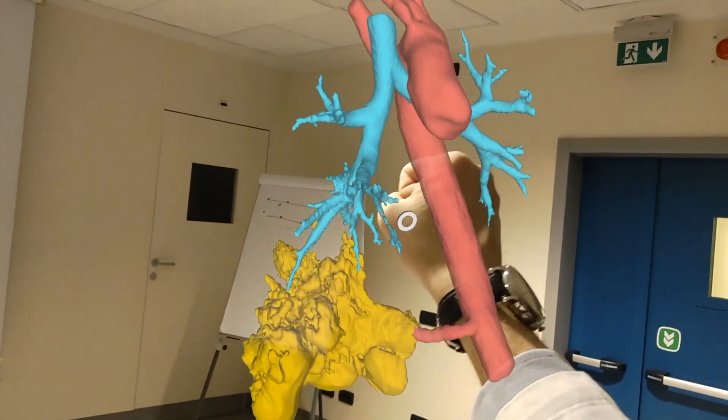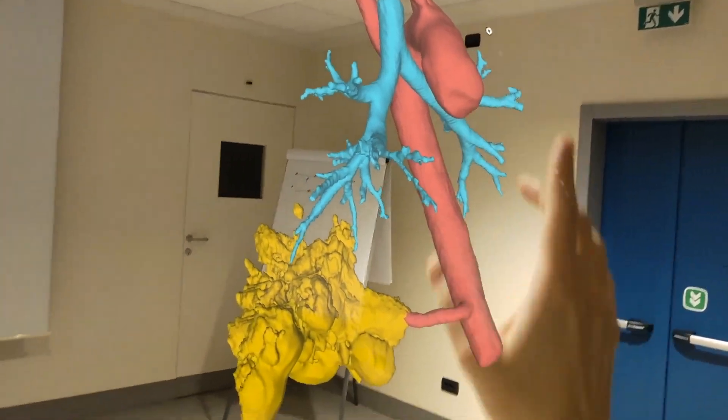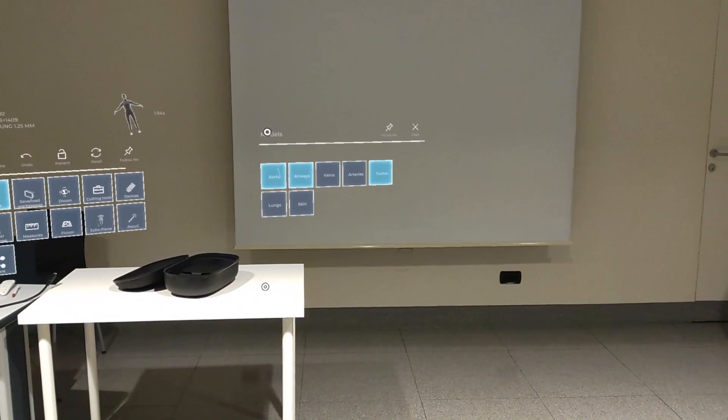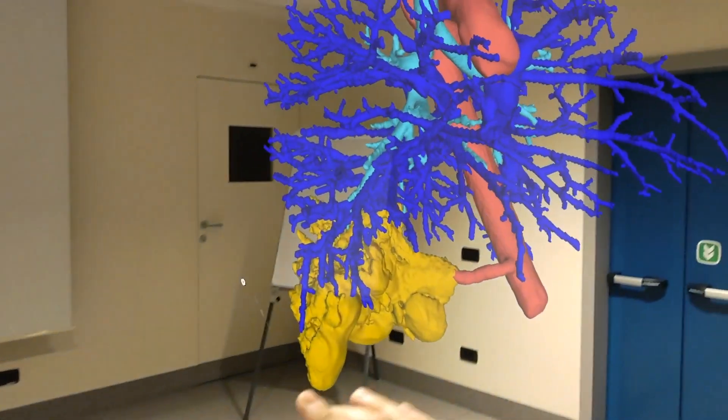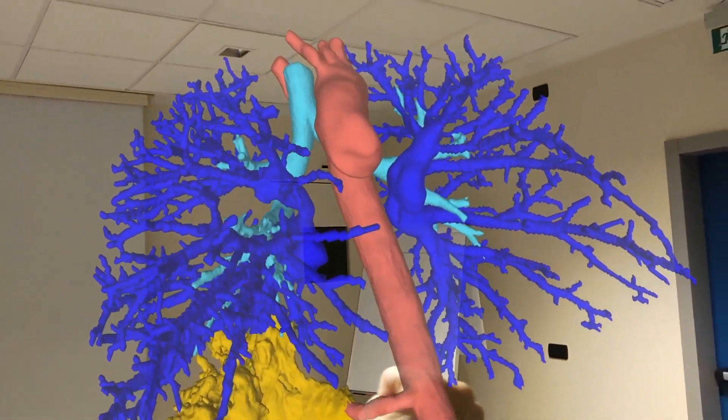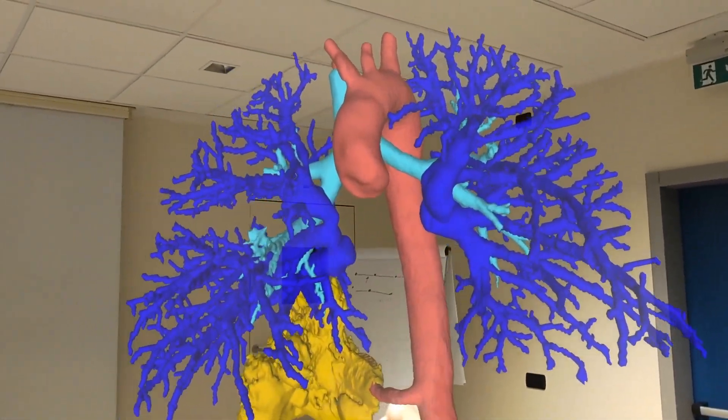After visualizing the pulmonary artery together with the bronchial tree to better localize the artery branches, we can remove the bronchial tree and focus only on the artery branches.